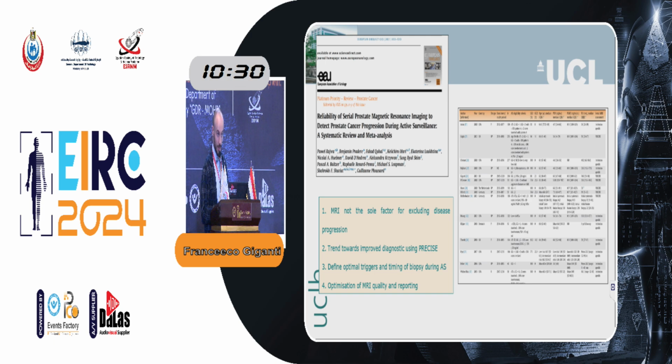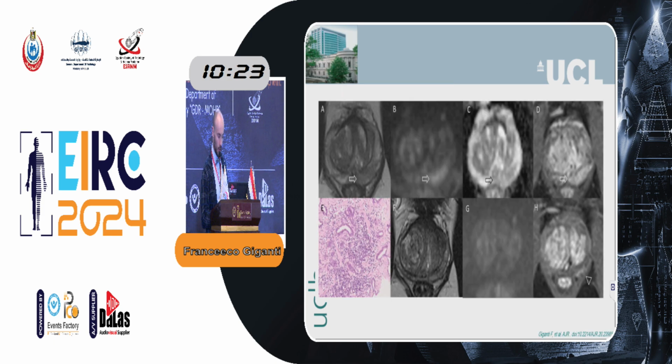MRI has been shown to be promising in the active surveillance setting, especially the PRECISE scores. And here you can see all the studies that used a scoring system for active surveillance, but there is still a lot of work to do.